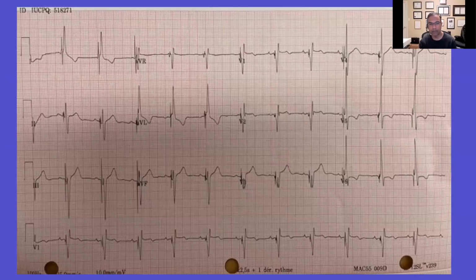It's interesting that if you look at the lateral precordial leads, V5 and V6, you see a little bit of that upslurring that Klaus had been referring to before. And in V1, it's hard to say from a television screen at a distance, but I would argue there's almost no latency there. In fact, you're seeing a little bit of down slurring, almost like pre-excitation, and certainly in AVL and 1 you see that delta wave type pattern as well. The morphology looks nice and the QRS duration is pretty nice, but I wonder if this is really selective left bundle pacing.